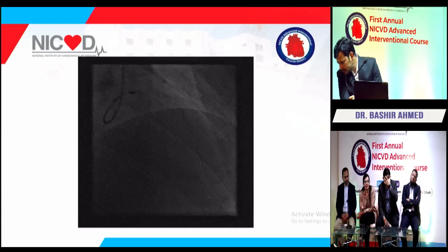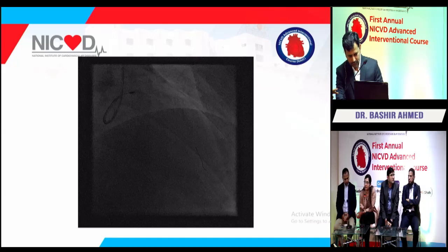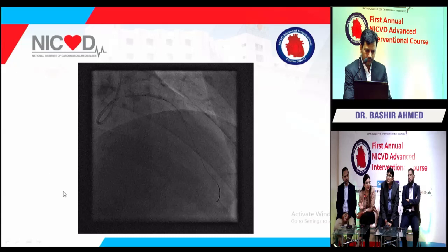The rule is that the burr size should be less than half of the diameter of the vessel that you can see. You never go more than 0.7 artery to burr ratio. First, 1.25 up to 1.75 burrs can be easily crossed via a 6 French sheath. A 2.0 burr requires a 7 French, and anything above that requires an 8 French. So most of the cases you would easily do with a 1.5 burr.